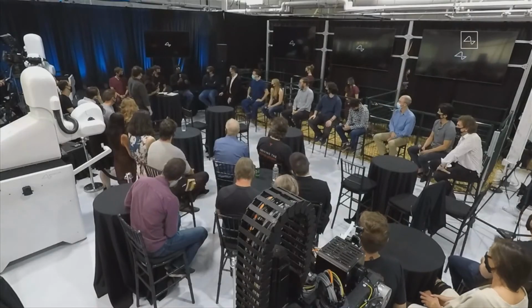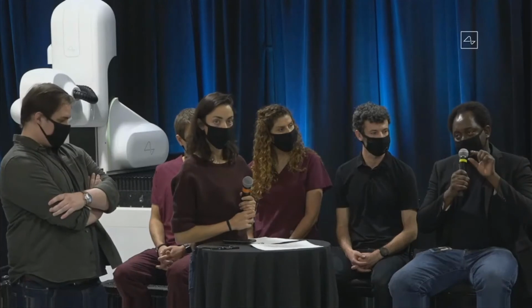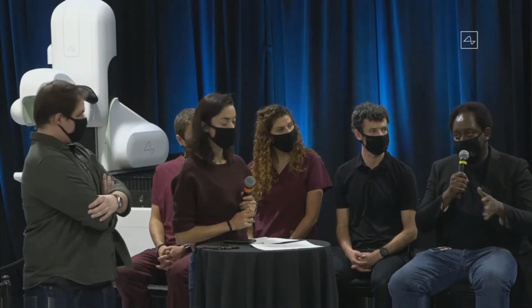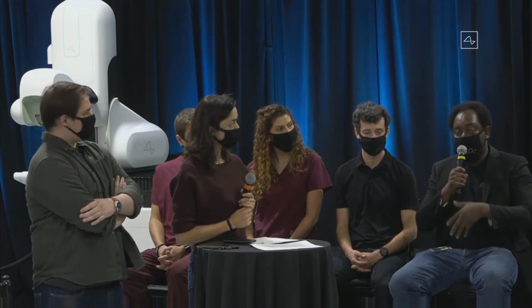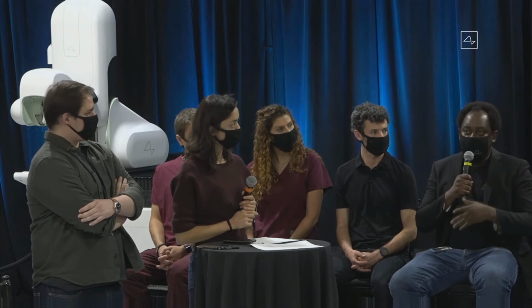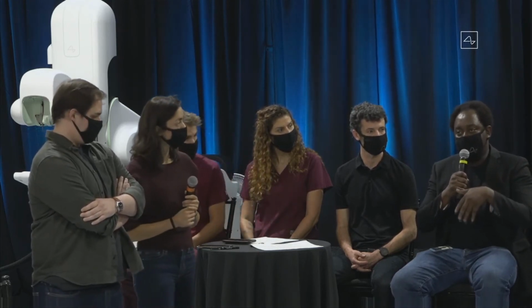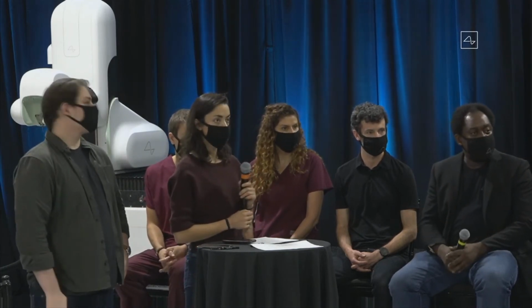So I just want to add to what you just said. The threads are actually also in the brain, and because of their thinness, they're very flexible. And so as the pig is moving around and banging its head, the threads actually move with the brain, even with the normal pulsation of the brain. And that helps minimize stress within the brain tissue, which has a long-term impact on the functionality of the device. Zach, how long are the threads?